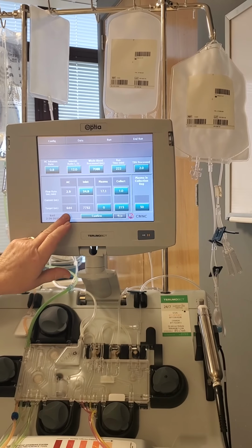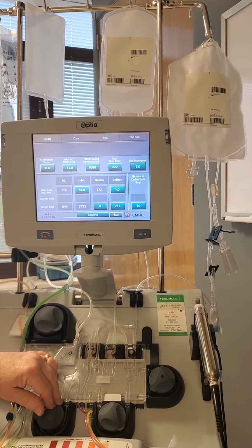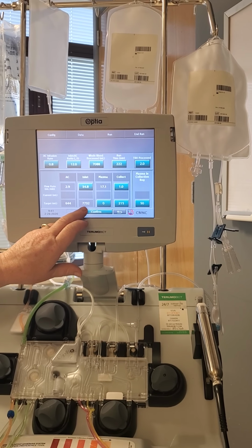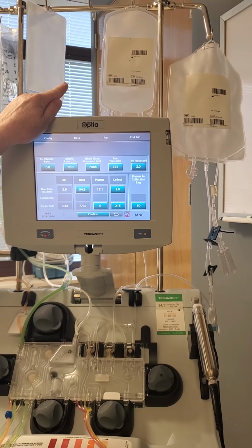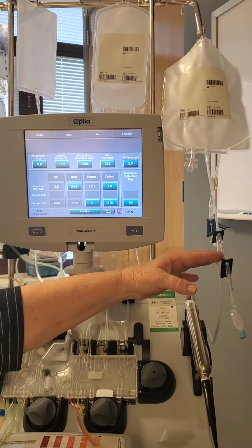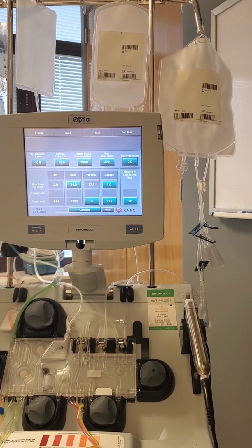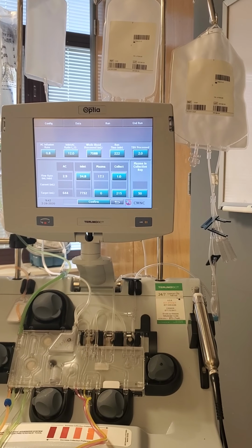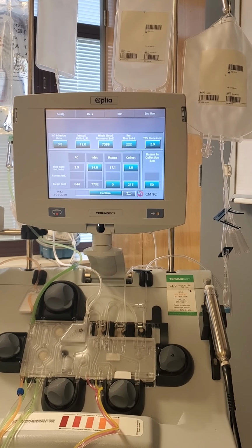We're going to need 644 mils of citrate. Over the inlet pump, this is the pump that pumps your whole blood and the citrate to the centrifuge. We are going to process 7.7 liters. There will be no plasma in the concurrent plasma bag. In the collect bag, there's 215 mils of cell product. And added to that will be what? 50 mils of what? Plasma. Plasma's going in that bag as well. Okay? So those are the run values, the pump flow rates and volumes.